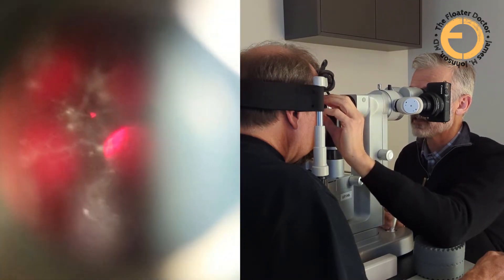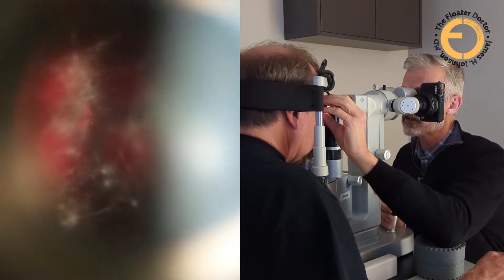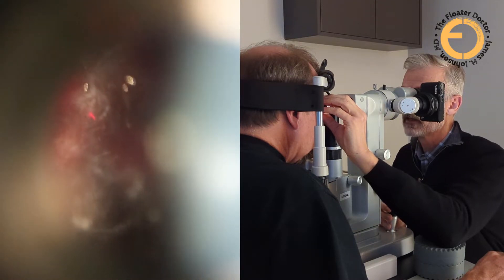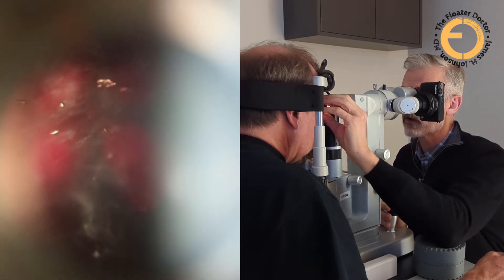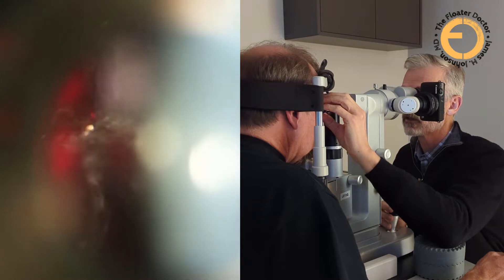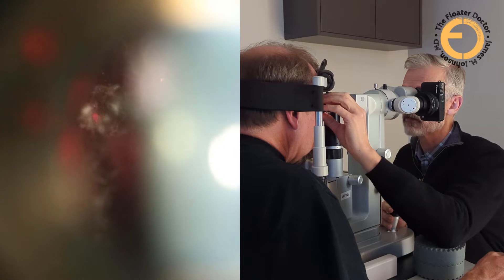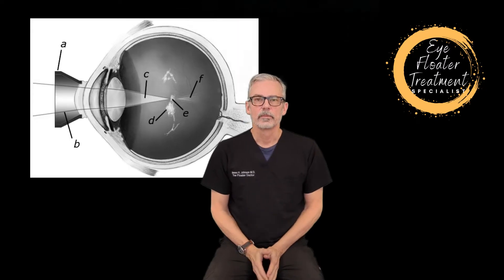This stuff is not my favorite. The first shot of laser — I don't know how to quite prepare you for it — but it's basically that, and then that, and then we just rinse and repeat and keep doing it. When I hit this stuff you'll see it kind of bounce around a bit. Every shot of the laser is a new decision because things move, so you can't really pre-plan this treatment and you can't use software. You just have to fire a shot, make a new decision, go to the dense area, and start going in there.